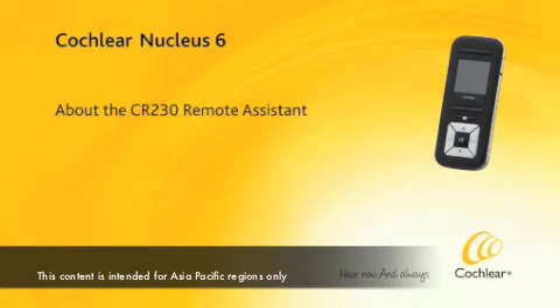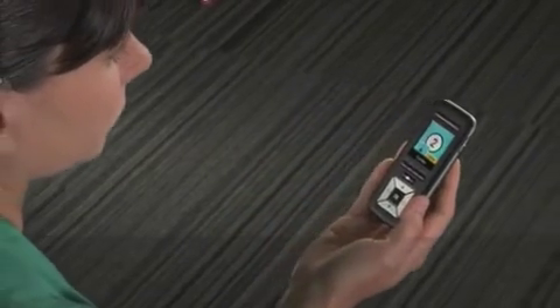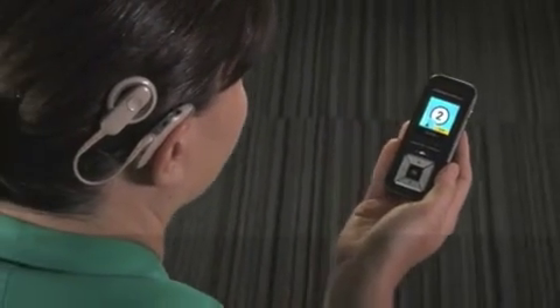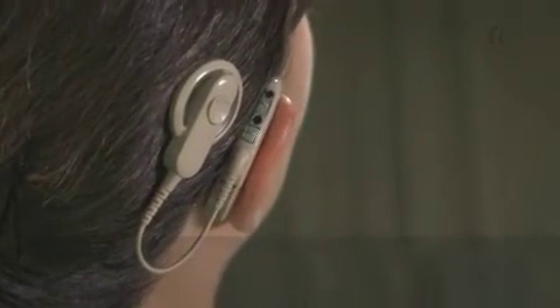About the CR230 Remote Assistant. The Cochlear Nucleus CR230 Remote Assistant is a handheld device that allows you to control and monitor the Cochlear Nucleus CP910 or CP920 sound processors.